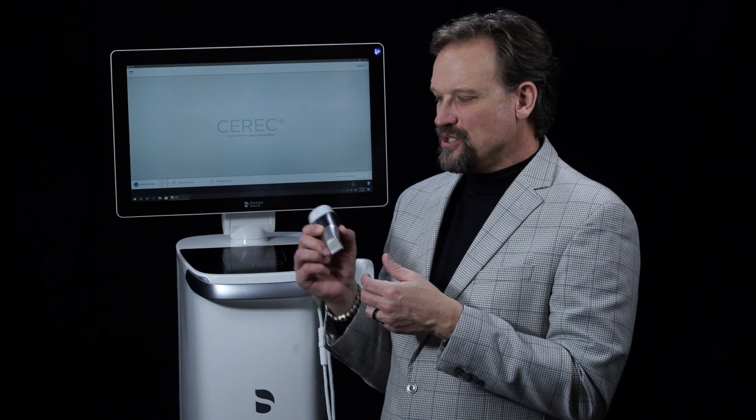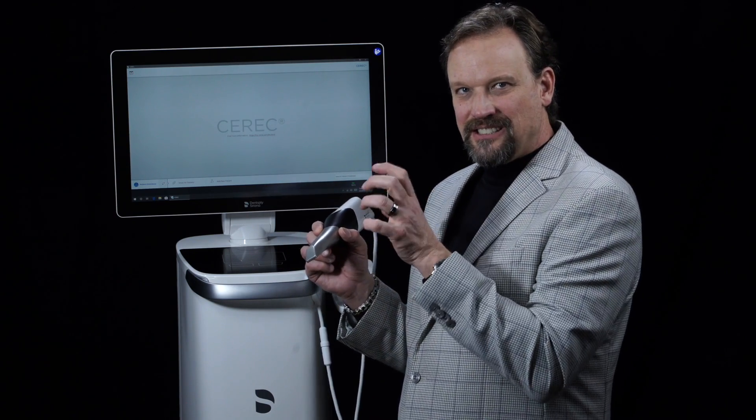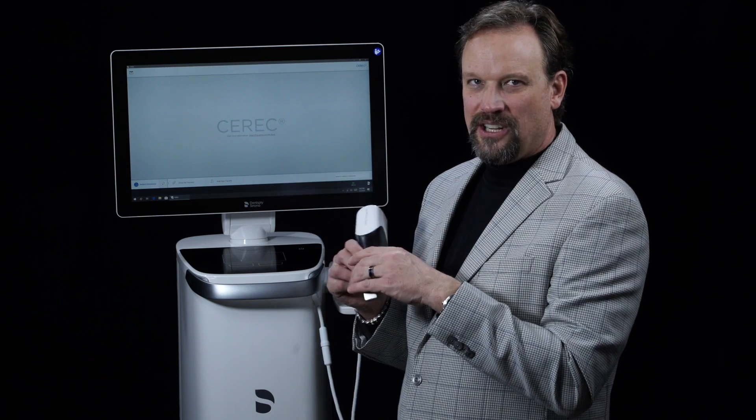Another really neat thing is that it has a motion sensor. All you have to do is grab the camera — it senses that it's been moved and the camera kicks on automatically.